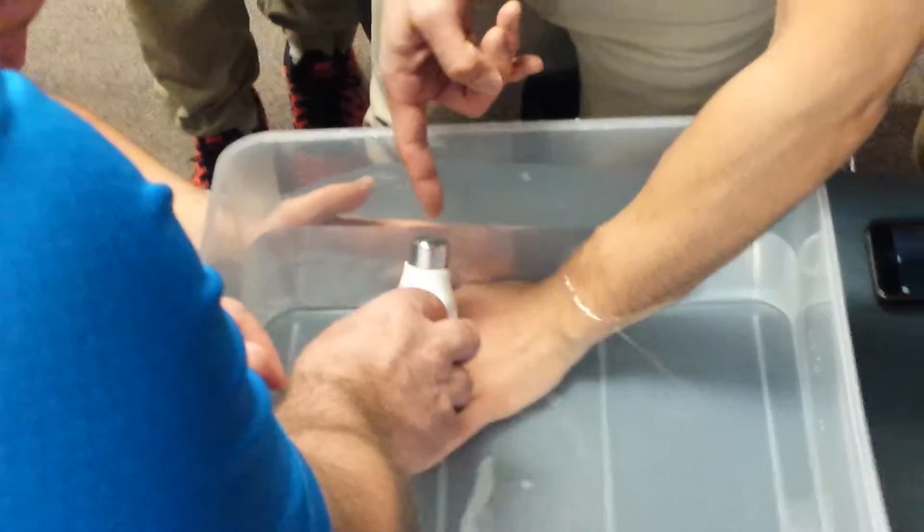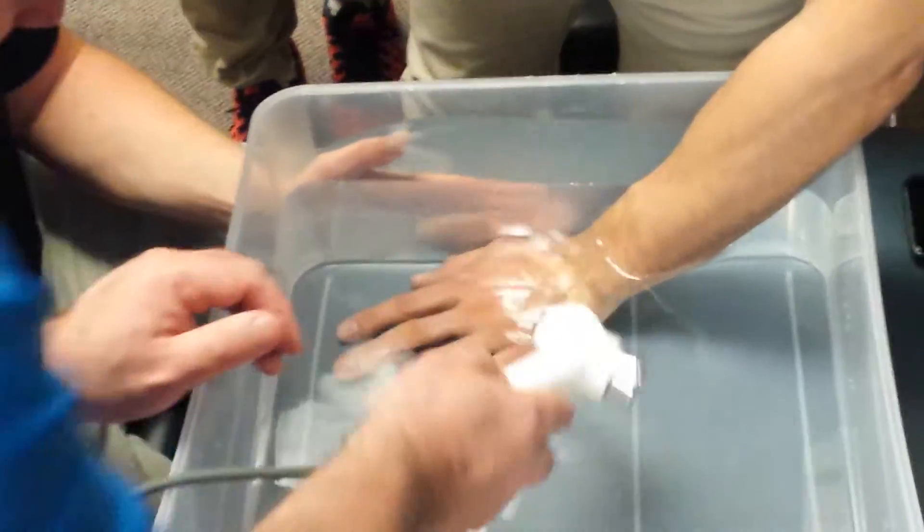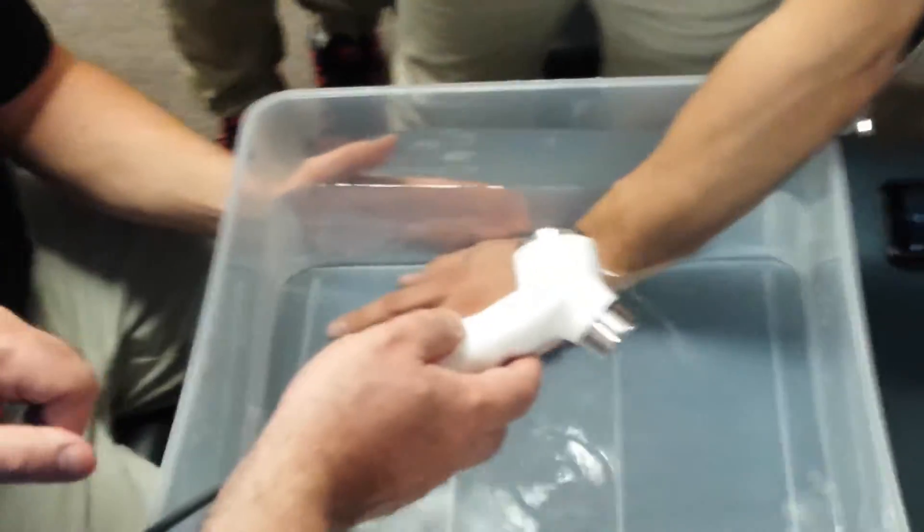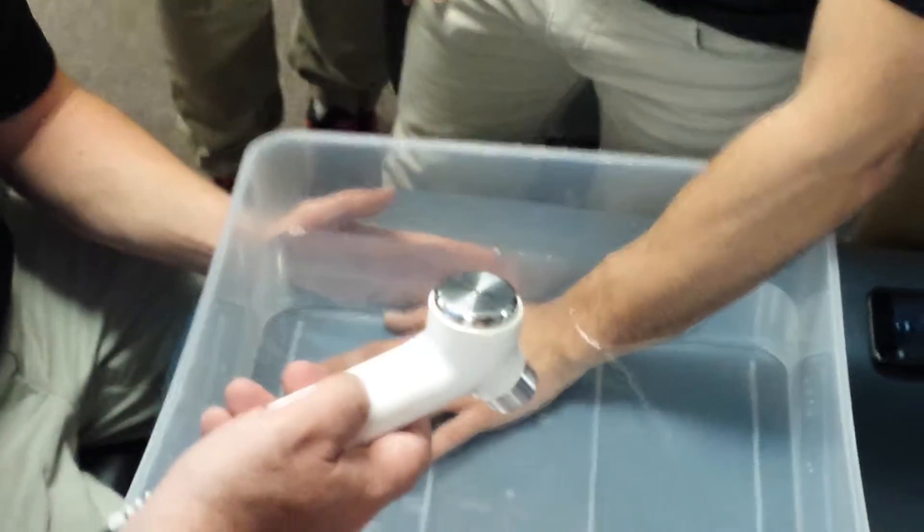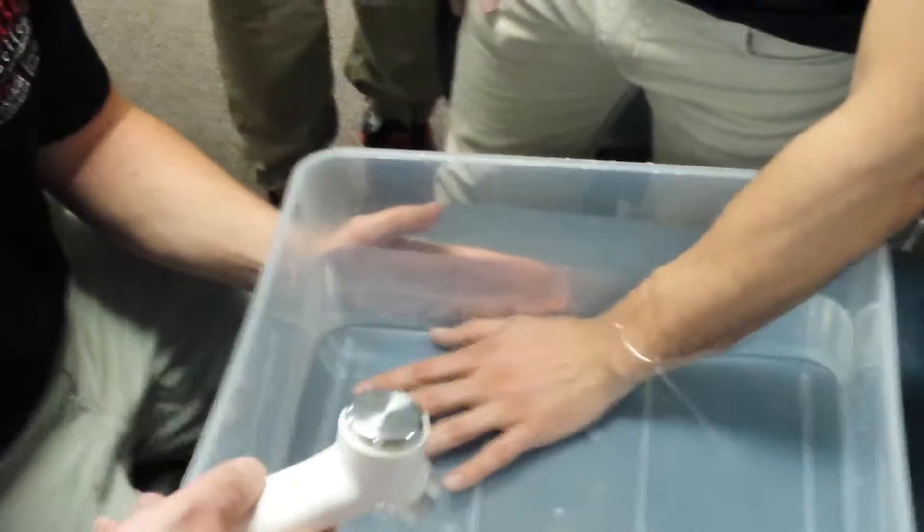How do you know it's 100% waterproof? Sure. Oh waterproof. It's just they're all that way. Oh, they're all waterproof. Well, I shouldn't say. You might want to double check, but I have not seen.